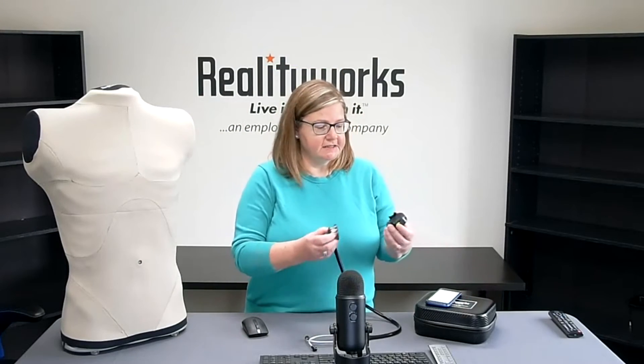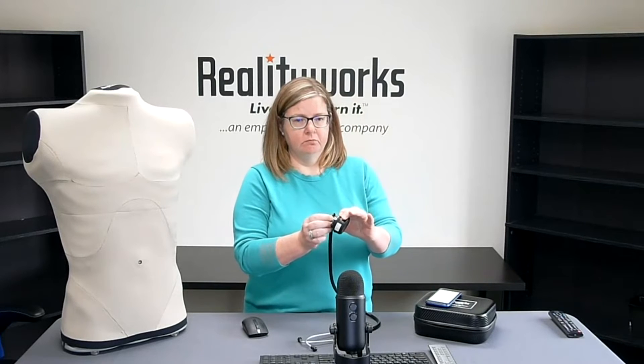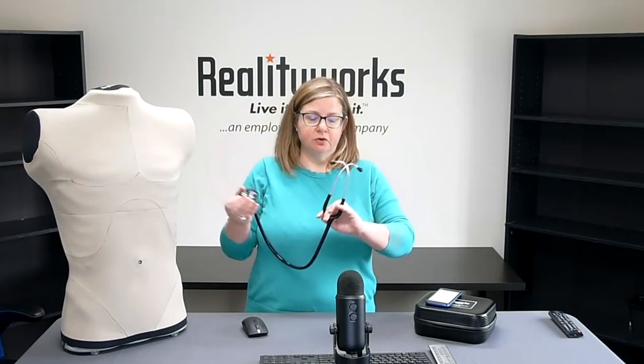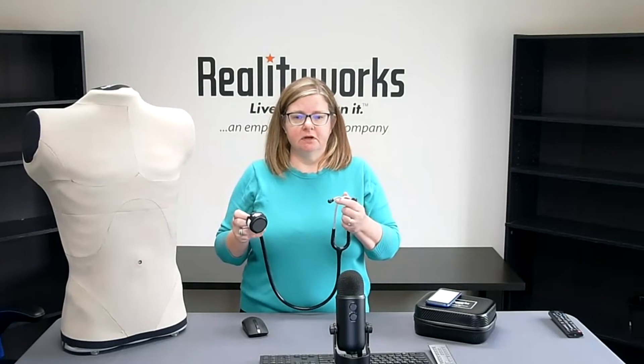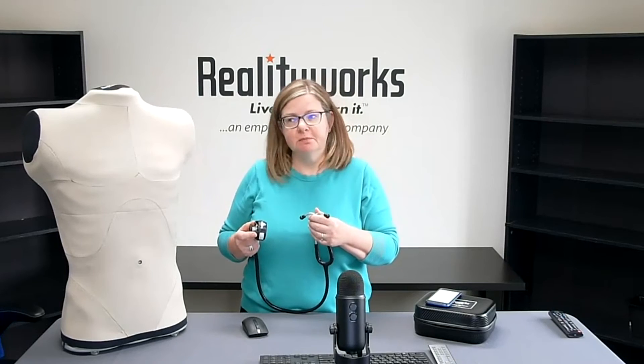The second way is to attach the reality scope to any stethoscope by just sliding it over the bell, and you can listen to the sounds right on the torso itself. This type of practice adds in correct stethoscope placement to hear the sounds — the torso and reality scope are designed so that sounds will not be audible if the stethoscope is not in the correct place. For an added challenge, apply the skin overlay to the torso to add realism to the practice session.